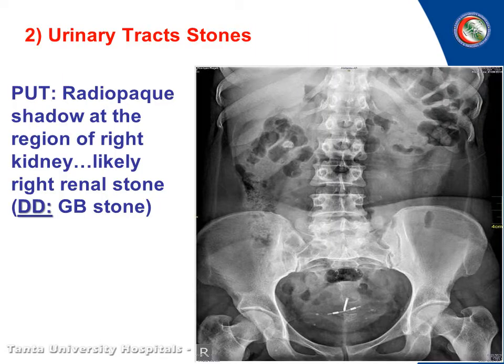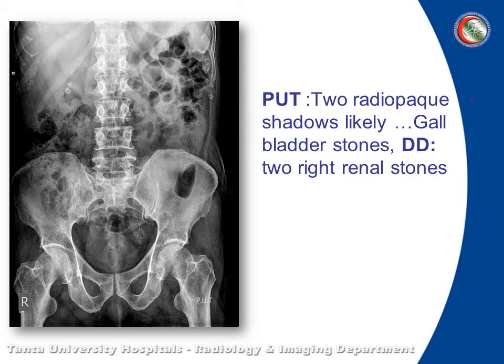In urinary tract stones, we depend on radio-opaque shadow on plain X-ray. Like this one — there is a radio-opaque shadow in the right hypochondrium, so it could be gallbladder stone or renal stone. In this image it is a renal stone with differential diagnosis of gallbladder stone. And this one is gallbladder stone — it is much higher than the previous one.